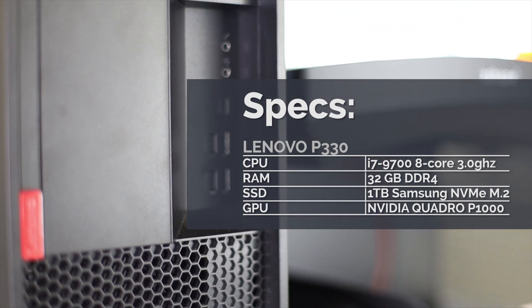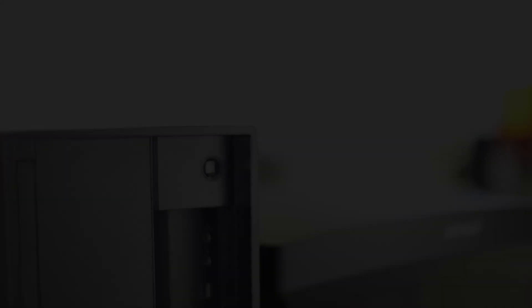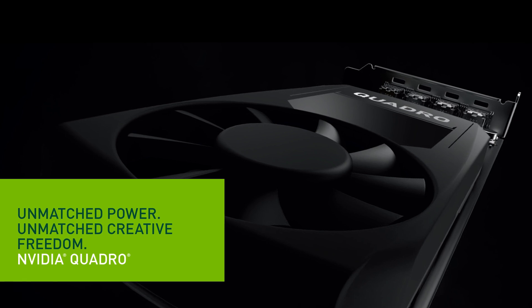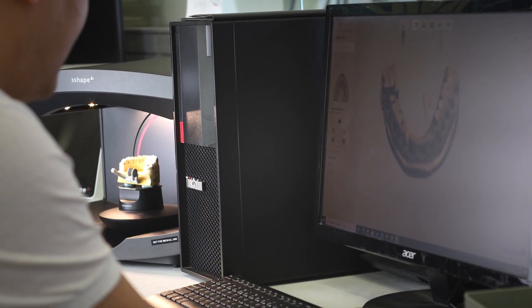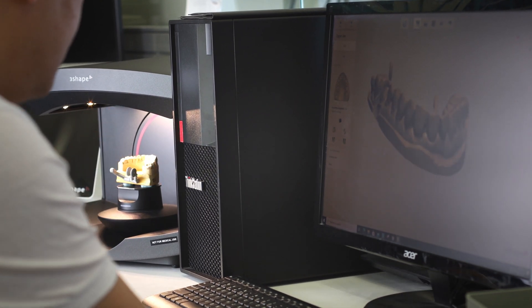The most interesting thing about this generation of PCs is that it marks 3Shape's departure from gaming and enthusiast-level graphics, switching to professional workstation graphics using Nvidia Quadro cards. The latest scanners and software have been optimized to utilize the graphics processing capabilities of the Quadro cards to speed up post-processing.